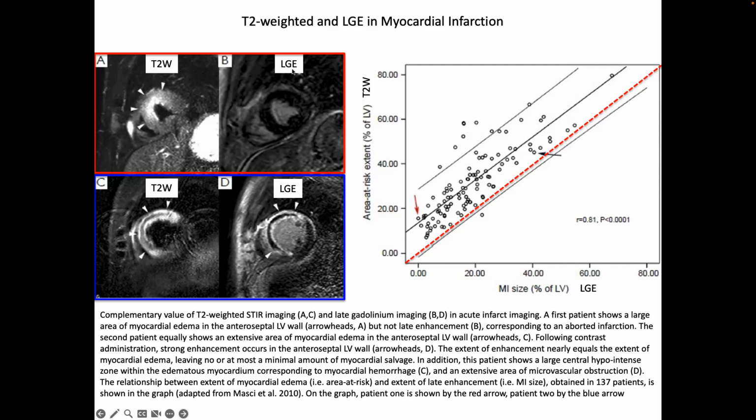When you look at the late gadolinium enhancement of that tissue, it just doesn't enhance. So it's not dead, right? These cells are still fighting. They're still going for it.